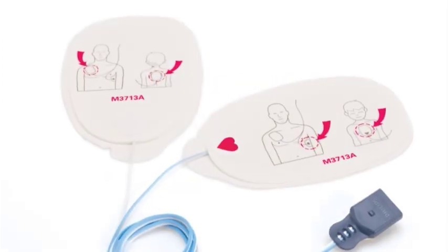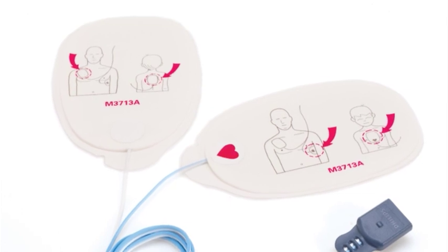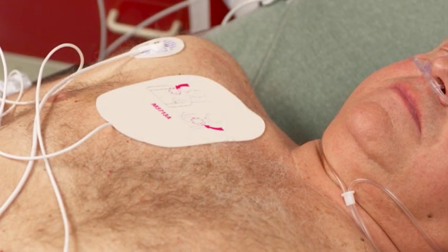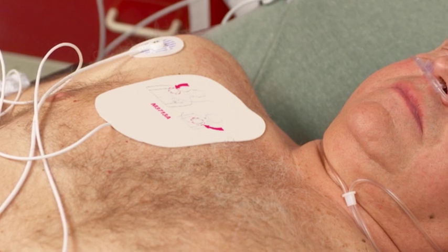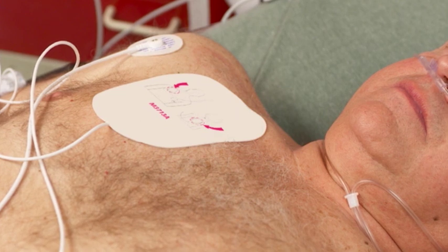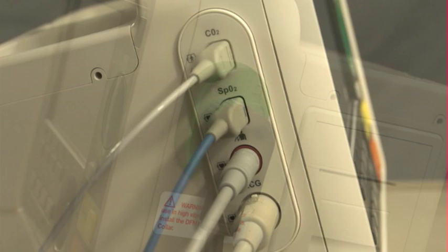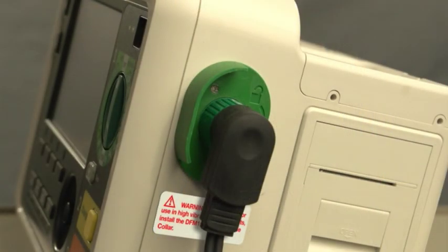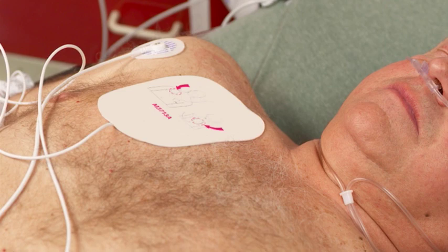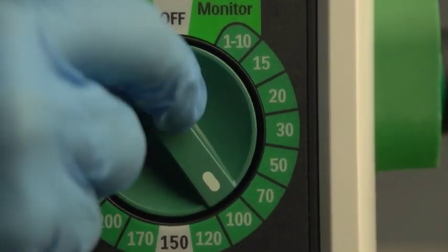Pacing requires the use of the multi-function pads to deliver the paced pulses. During demand mode pacing, the multi-function electrode pads cannot be used for ECG monitoring. You must monitor the patient through three or five lead monitoring electrodes. Assuming the ECG and therapy cables are connected to the DFM-100 and monitoring electrodes and multi-function electrode pads applied to the patient's bare chest, turn the therapy knob to the pacer position.